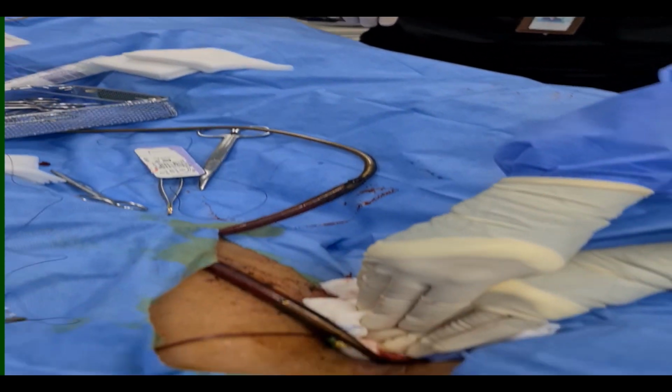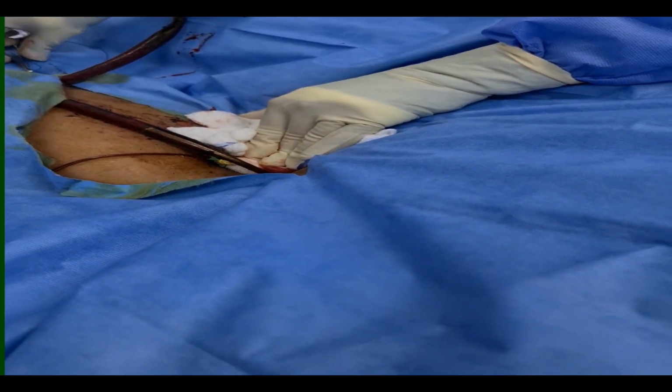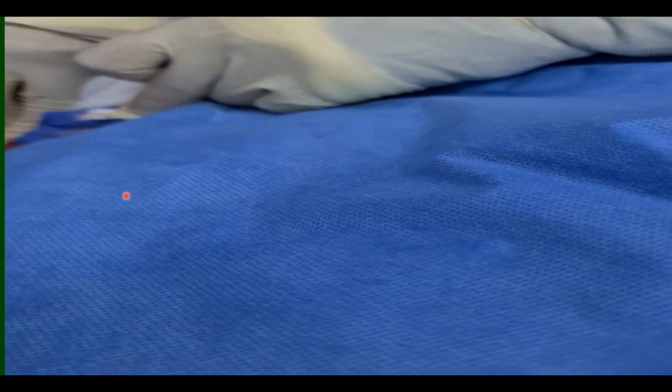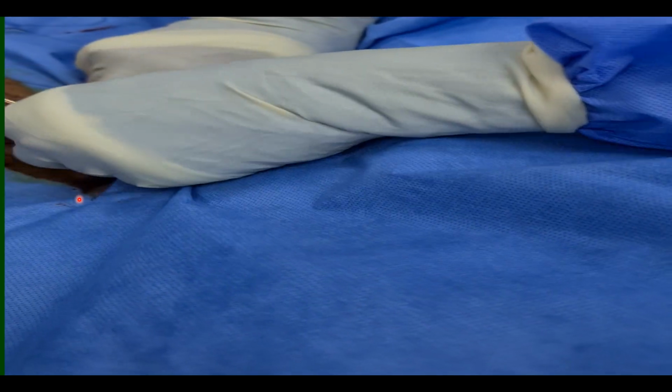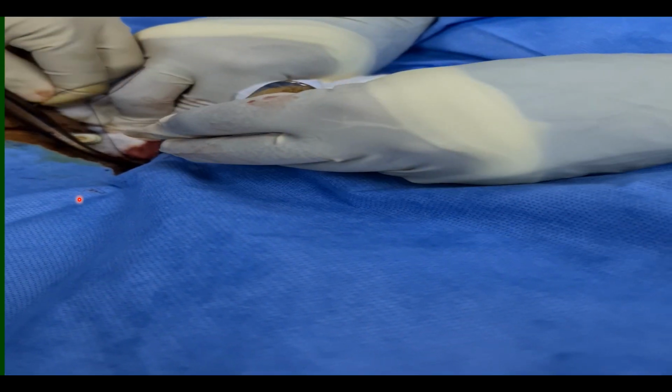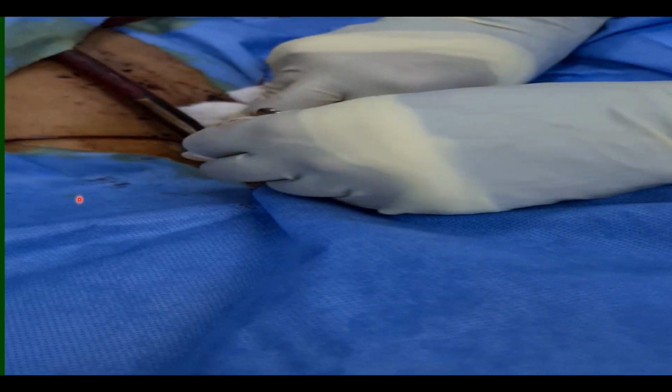This is the second part of the decannulation video. After they remove the venous cannula, one of the operators is compressing at the cannula site to avoid formation of hematoma or bleeding from that site. This cannula is the arterial cannula, where they will do the same purse-string sutures all around the cannula and tighten firmly to remove the arterial cannula.